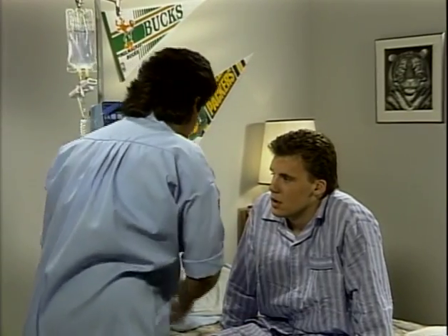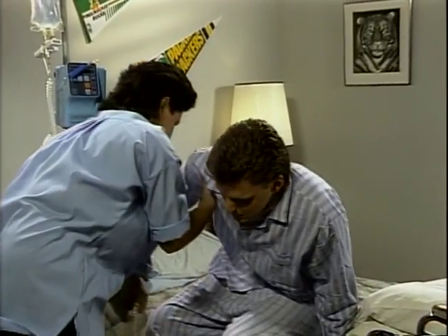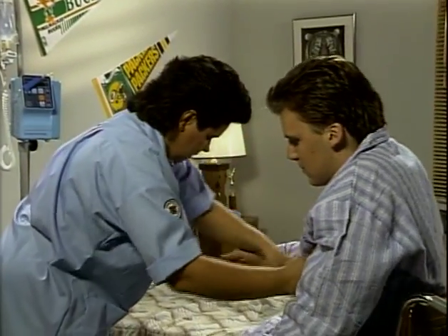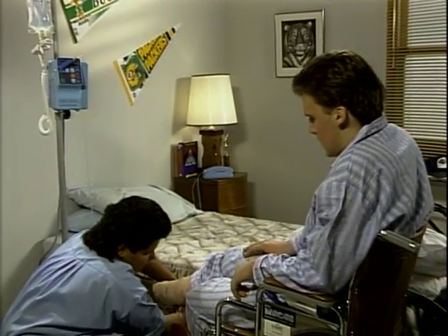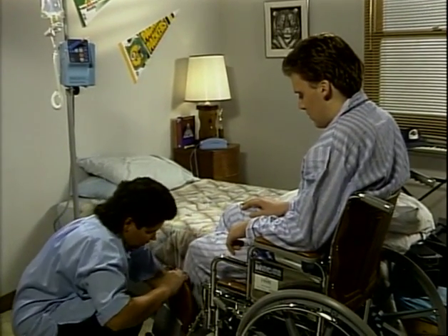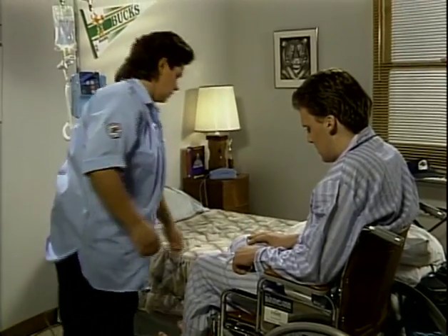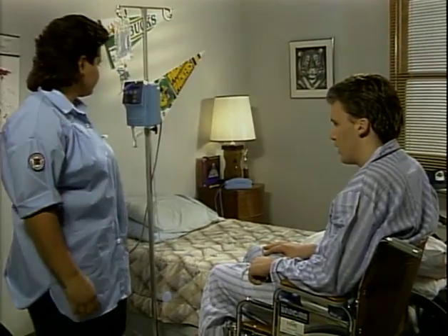Norma will assist John to transfer into the wheelchair, and then wheel John and the pole into the bathroom. Before beginning this task, Norma evaluates any risk factors. John cannot bear weight on his right foot. She checks for any potential obstructions in their path, such as carpeting, low door frames, ceiling fans, or chandeliers. She will explain the procedure to John before beginning the transfer, so he does not bear weight on his injured foot. And she will keep a watchful eye on the tubing.